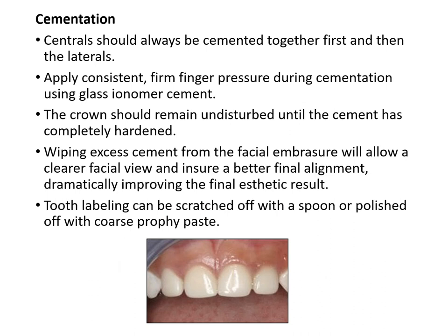For cementation, always cement the central incisors together first, then the laterals. Apply consistent finger pressure during cementation using glass ionomer cement, keeping the crown undisturbed until cement is completely hardened. Wipe excess cement from facial embrasures for a clearer view and better final alignment — ensure the crown is seated in the correct direction. Tooth labeling can be scratched or polished off with a coarse prophy paste. The final result is very aesthetic, and lacerated gingiva from sub-gingival preparation heals within approximately two weeks post-operatively.